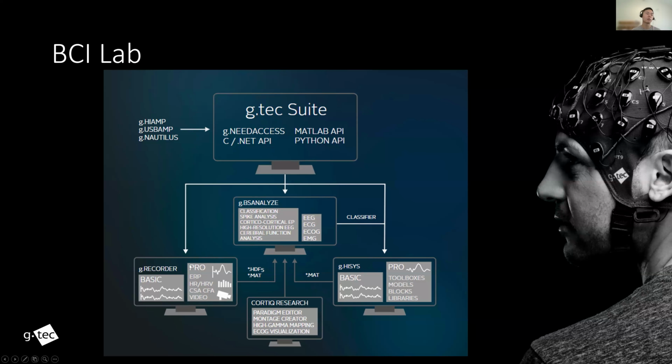If you're doing a really simple experiment, let's say an EEG plus EKG experiment, you can directly plug the cable into the original amplifier and measure everything on the recorder. But if we're talking about fNIRS, eye trackers, more complex device combinations with the EEG, usually we do it through g.HIsys, which is under MATLAB Simulink.